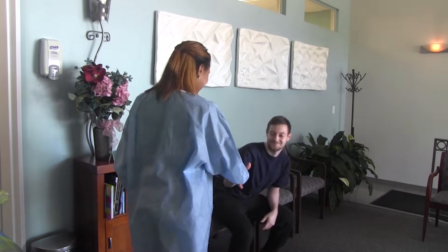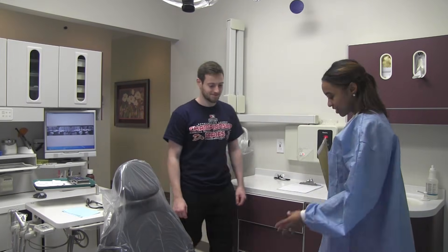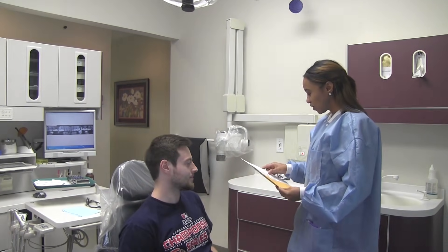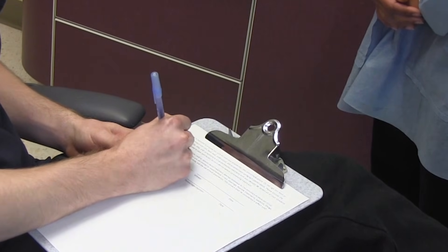Greet the patient and escort him or her to the operatory. Properly seat the patient in the dental chair. Confirm patient medical and dental history and explain the procedure, addressing any patient questions or concerns. Obtain informed consent.